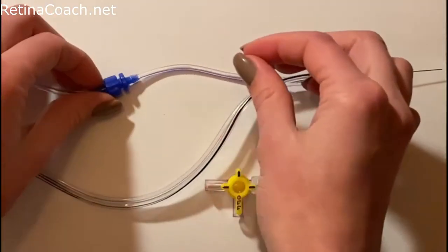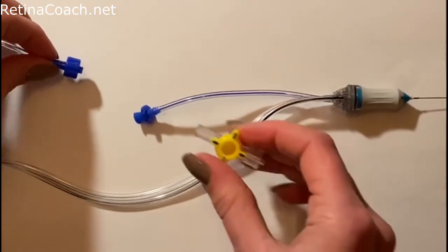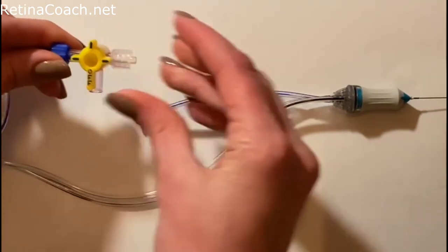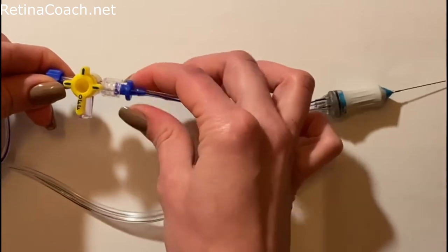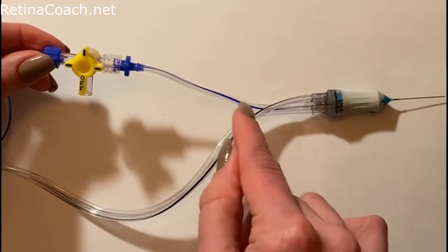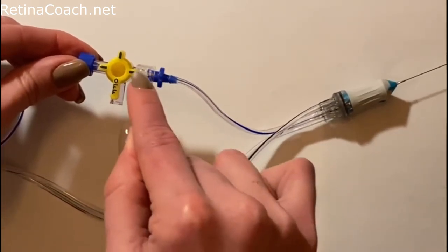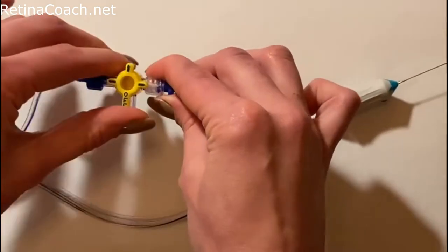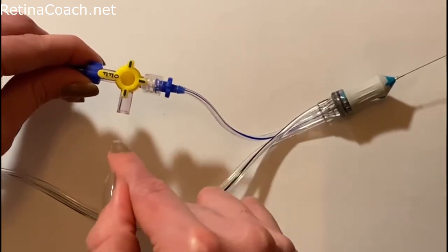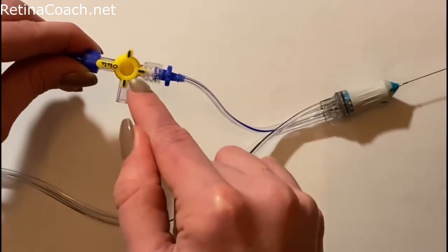One technique to prepare the vitrectomy system for diagnostic vitrectomy is by disconnecting the aspiration line and placing a three-way tap. When the valve is turned with off towards the side port, the aspiration material comes through the aspiration line, forced by the vacuum created by the vitrectomy system. When the valve is turned with off towards the line, there is no vacuum from the vitrectomy system. In this case, the syringe connected to the side port will create a vacuum sufficient for sample aspiration.